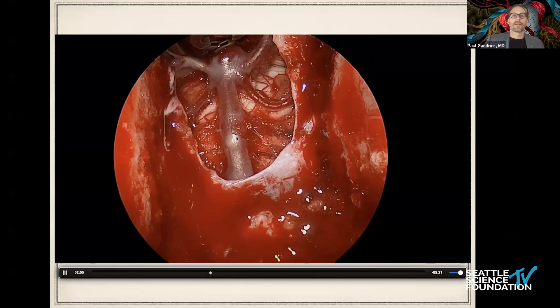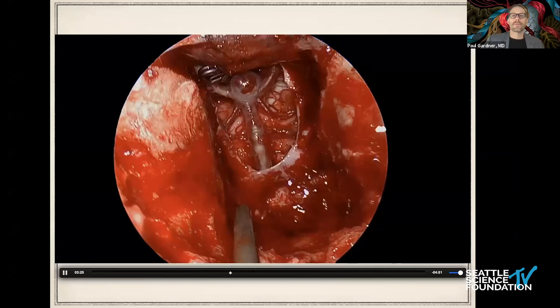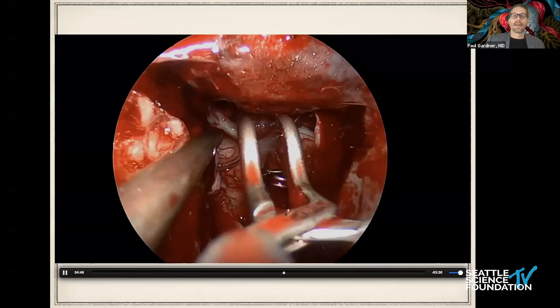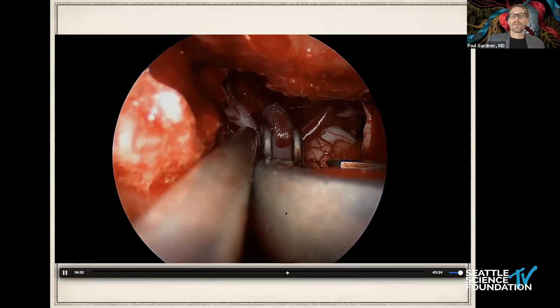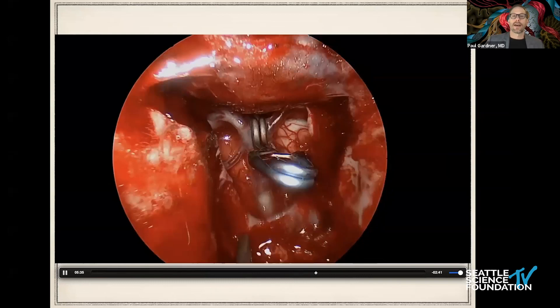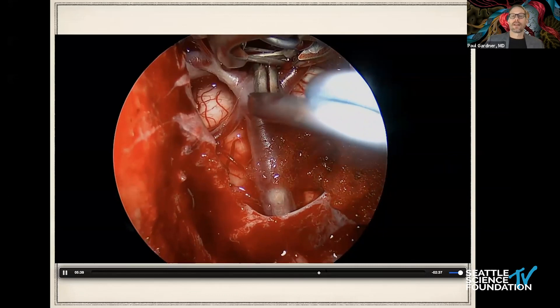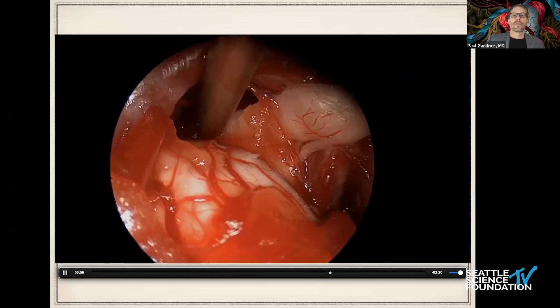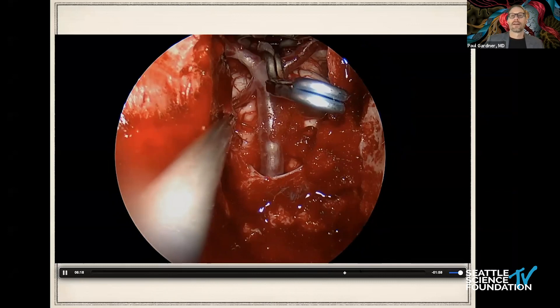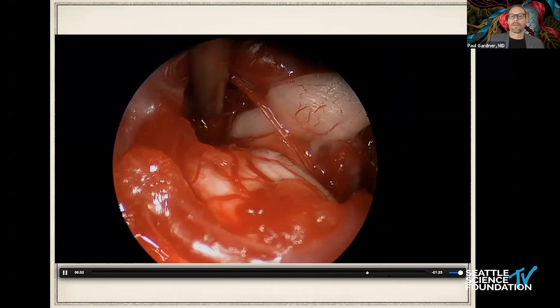I have access to the basilar trunk and can trap the aneurysm if needed. My initial clip slipped off because of too much turgor and this broad-necked aneurysm, so I had to remove it. With proximal control to decrease turgor, I did what's called a shank clipping with a bayoneted clip to grasp the front of this very broad-necked anterior-posterior aneurysm, then placed a fenestrated clip around that to get the deep part. I used the endoscope to look around the corner to check for perforators on the deep side — had to back it off slightly after picking up a perforator, then replaced it. The post-op shows complete treatment of that aneurysm.